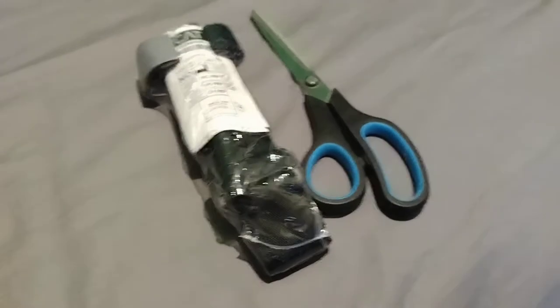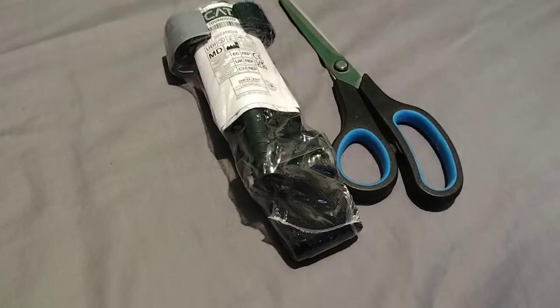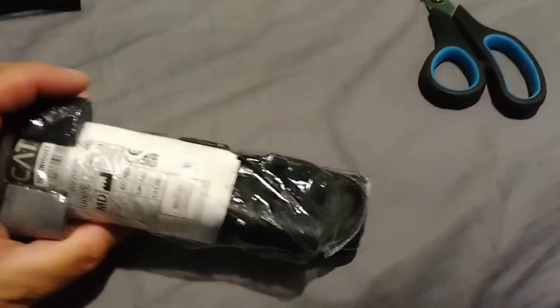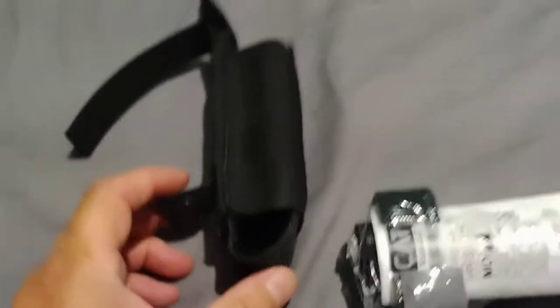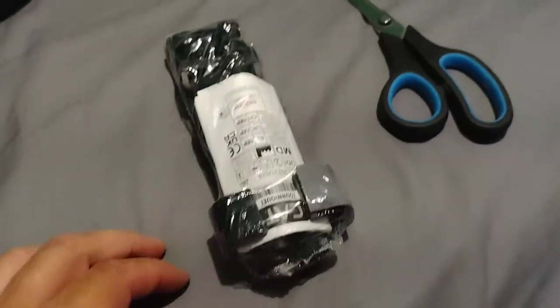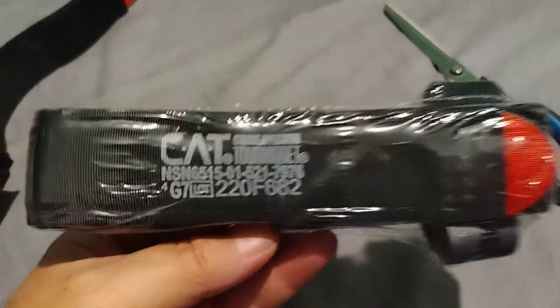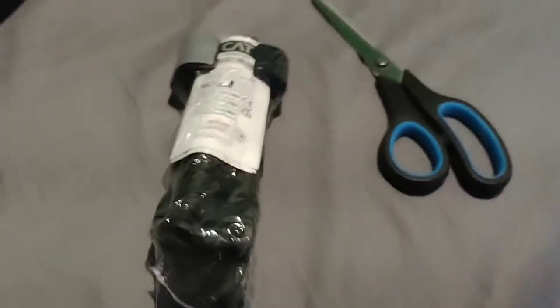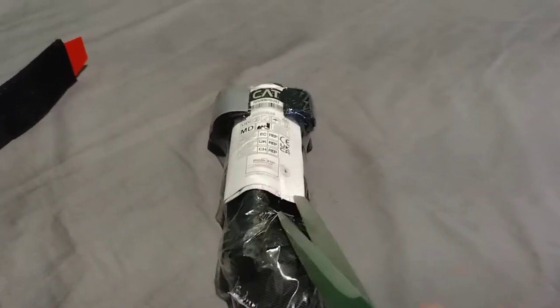This is my new Gen 7 CAT tourniquet that I just purchased on Amazon from Rescue Essentials. I unboxed or unwrapped this cover yesterday, but I didn't take the time to unwrap the tourniquet itself. This is a CAT - a combat application tourniquet. I'm going to open it up for a review. This is going to be a bit tricky because I only have one hand to do this with.